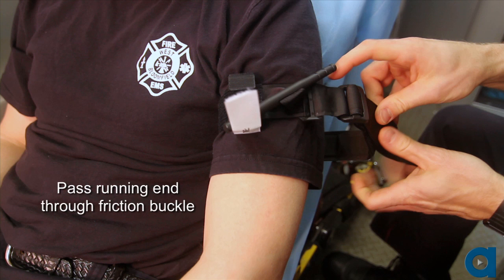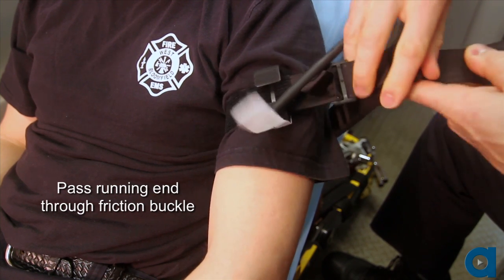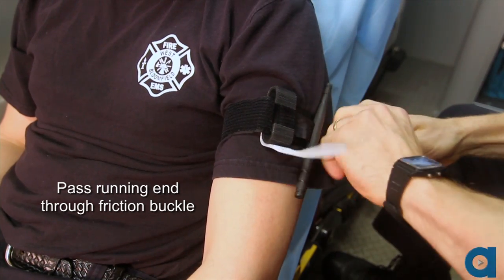Ensure that the free-running end of the self-adhering band is passed through the inside slit of the friction adapter buckle. Then pass the band through the outside slit of the buckle.